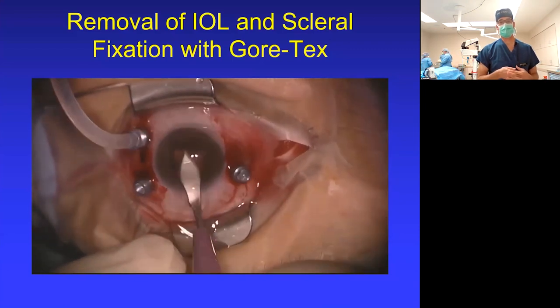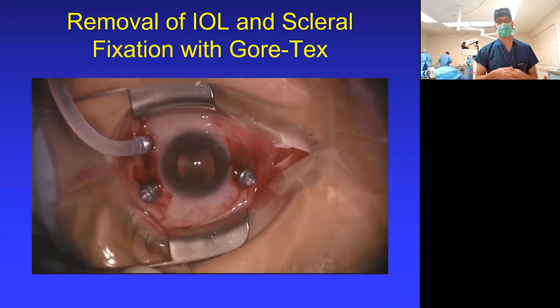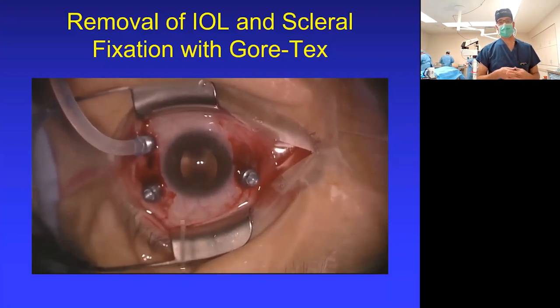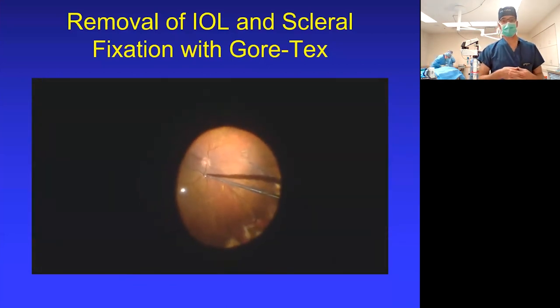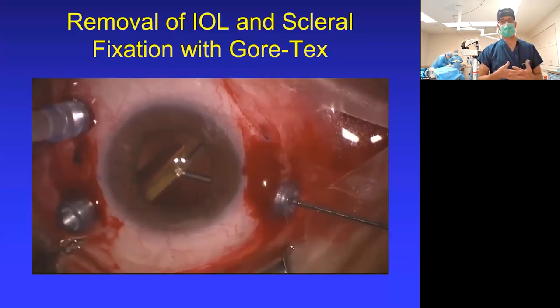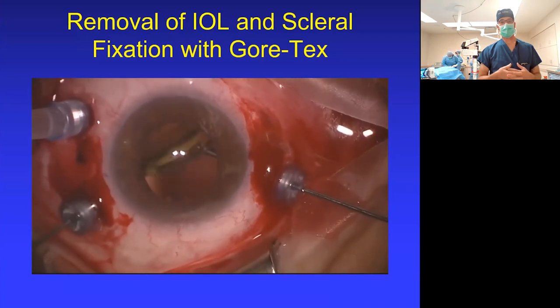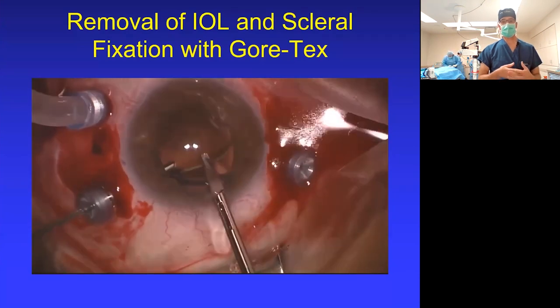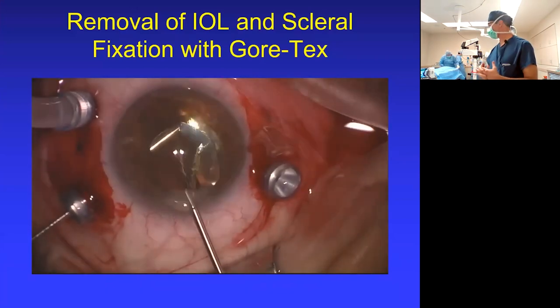Again, kind of high in the cornea, a little over 3 millimeters. You see me kind of carve that open a little bit on the corners. And we're going to grasp that with a forceps, or the retractor itself, actually. That's a single piece Acrysof type lens. We're going to bisect that, grab it, bisect it, pull it out through the wound. So I'm going to be showing you all this ideally live today here in just a few moments.